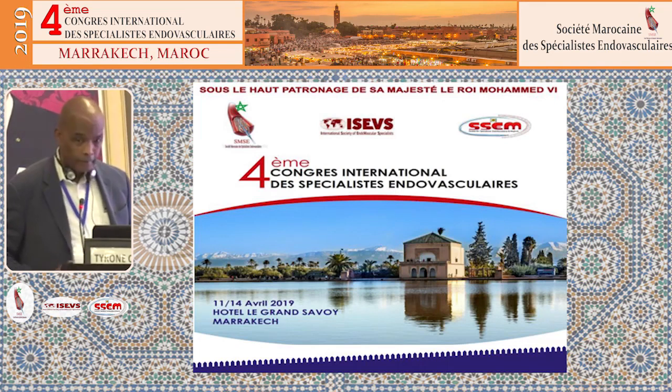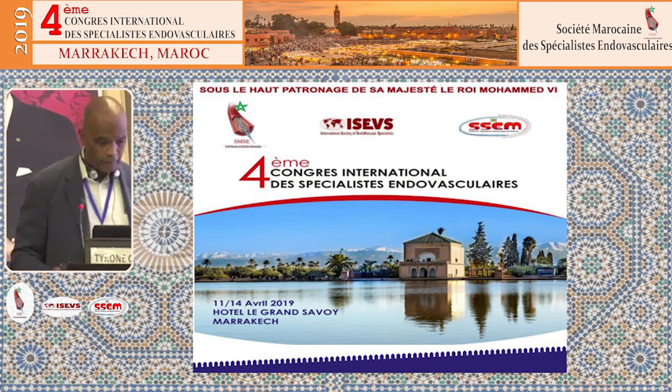Traditionally, the no stent zones were the common femoral artery, ostial superficial femoral, and profunda artery, the popliteal artery, and some people would even include distal bypass graft anastomosis. And that's part of the reason that you've been taught that. This is a slide that shows you stent fractures in the SFA.